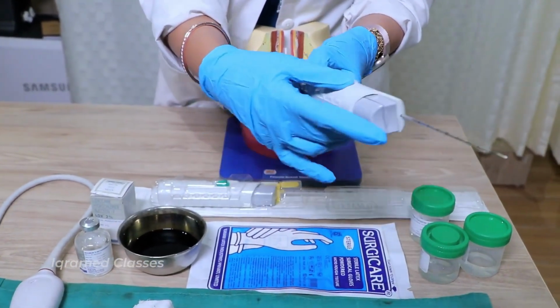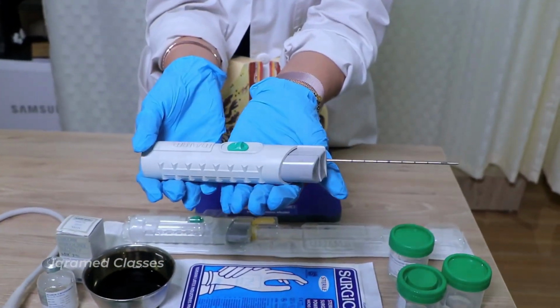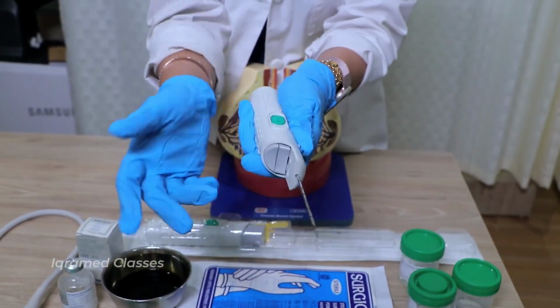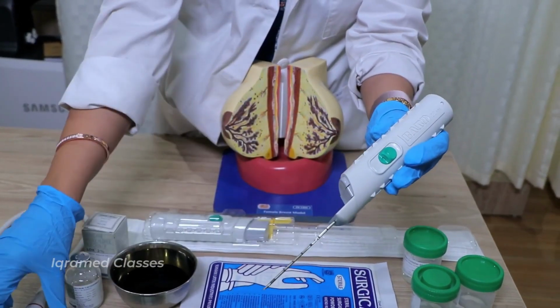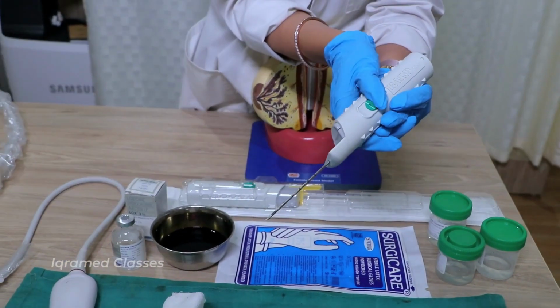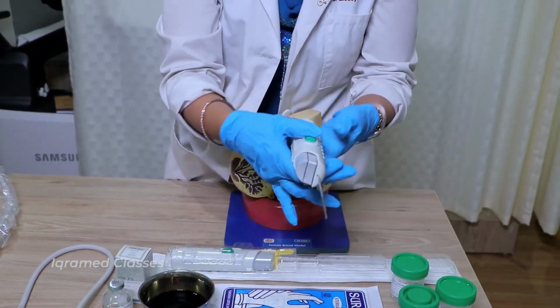How you have to use it? This is the neutral position. Now when you have to insert the gun, you have to pull one trigger, second trigger, and then you insert at the site. Once the site is finalized, under the ultrasound probe, you will then shoot, you will fire, and then take it out from the patient's site.